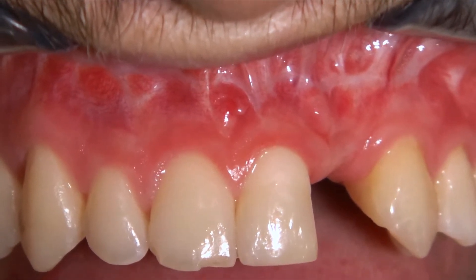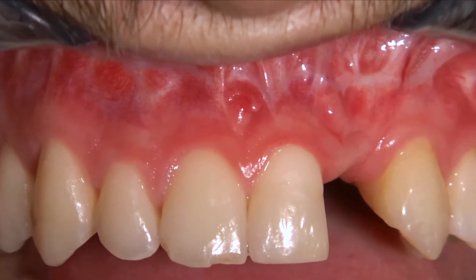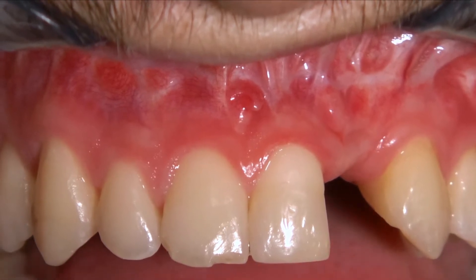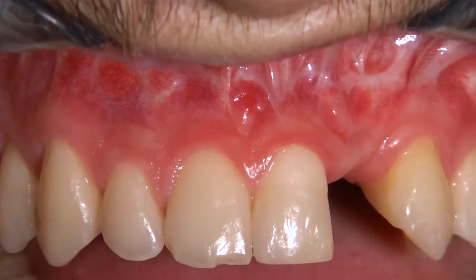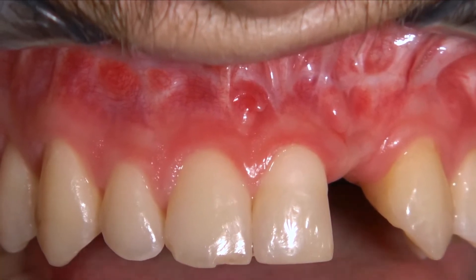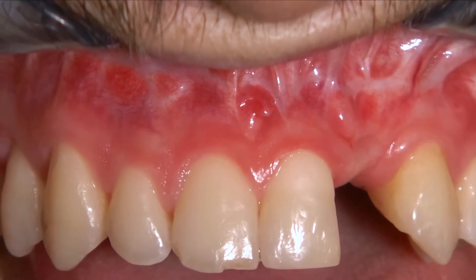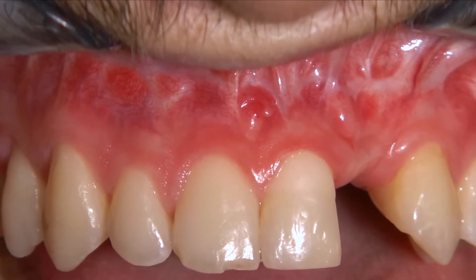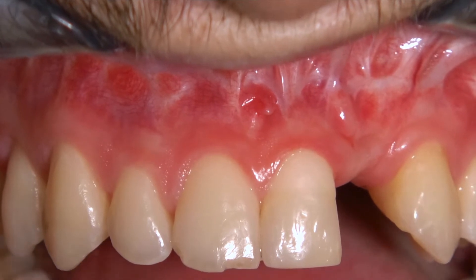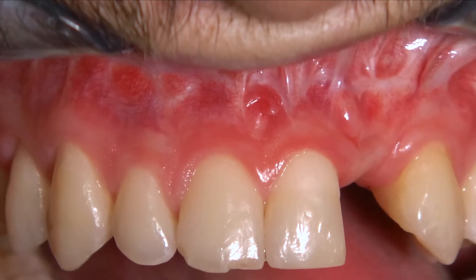You see that the big problem is trying to restore the lateral incisor by increasing the height of the papilla — distal to the central incisor, and a bit less also mesial to the canine. So we are in a situation of papilla loss, and that's why we have to make a soft tissue management of the dental site, like it is when we have a tooth to be extracted for periodontal reasons.